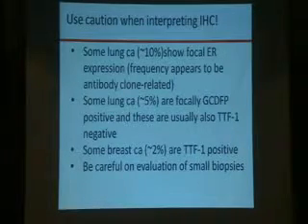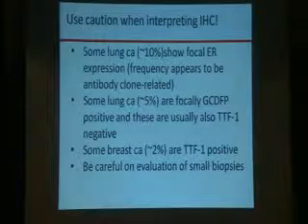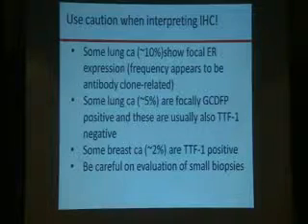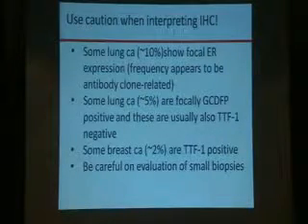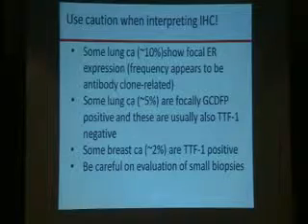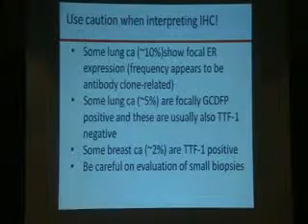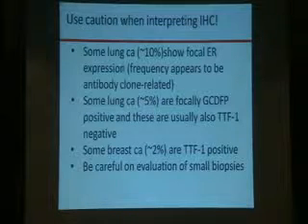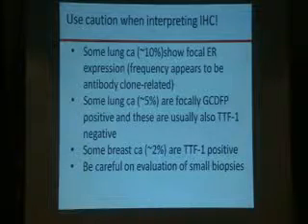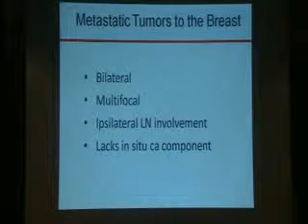And similarly, some lung carcinomas, it's less than 5%, but when you are dealing with a large number of cases, they can be gross cystic disease fluid protein positive, and they can be TTF1 negative. In our institution and many of the cases that we receive, the lung biopsies tend to be a lot smaller than breast biopsies. So when you are dealing with small biopsies, be extremely careful. With focal gross cystic disease fluid protein positivity, don't jump into a breast carcinoma diagnosis.